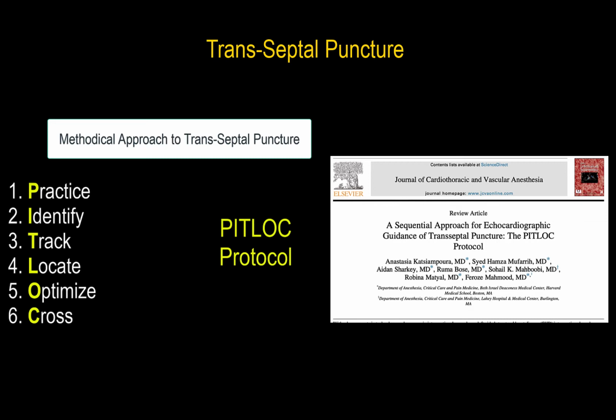And Feroz, this is a very good protocol, and even before the pre-planning stage, we should obviously be consulting with the interventionalists and determining where they want the site. Do they want it posteriorly, inferiorly? Where exactly is it that they want it? So there's an element of pre-planning as well. Exactly. So while it seems generic, it has to be modified to the patient-specific conditions that are present at that time.